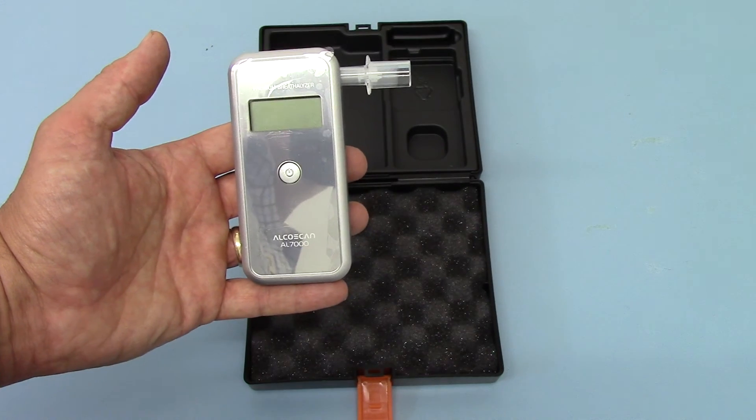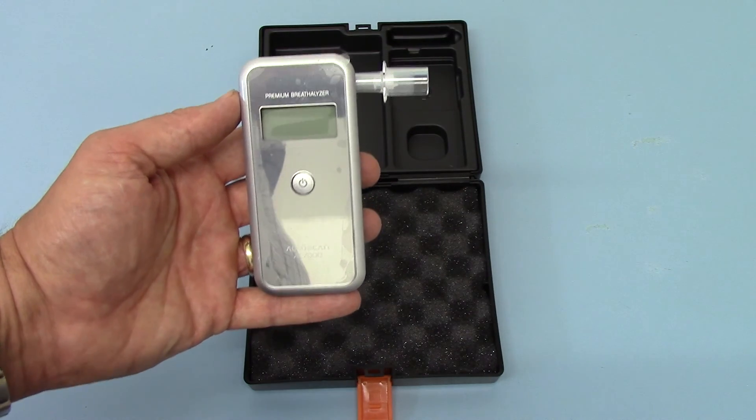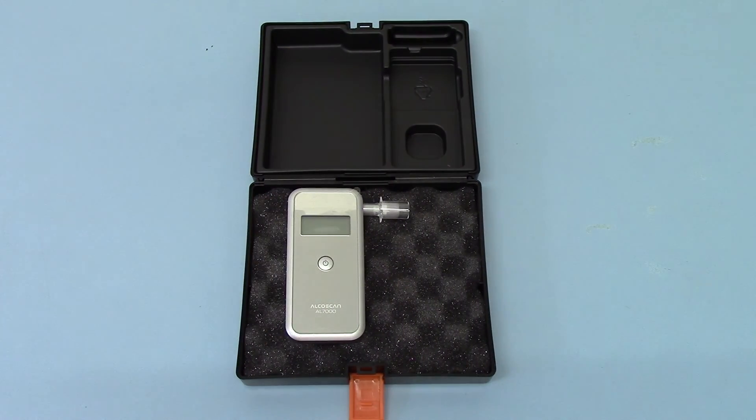If you want to compare the two, you need a conversion table so you can see what the equivalent blood alcohol is for the breath that's measured, and vice versa. The AL7000 digital breathalyzer is available from Value Breathalyzers' website, UK Drug Testing.